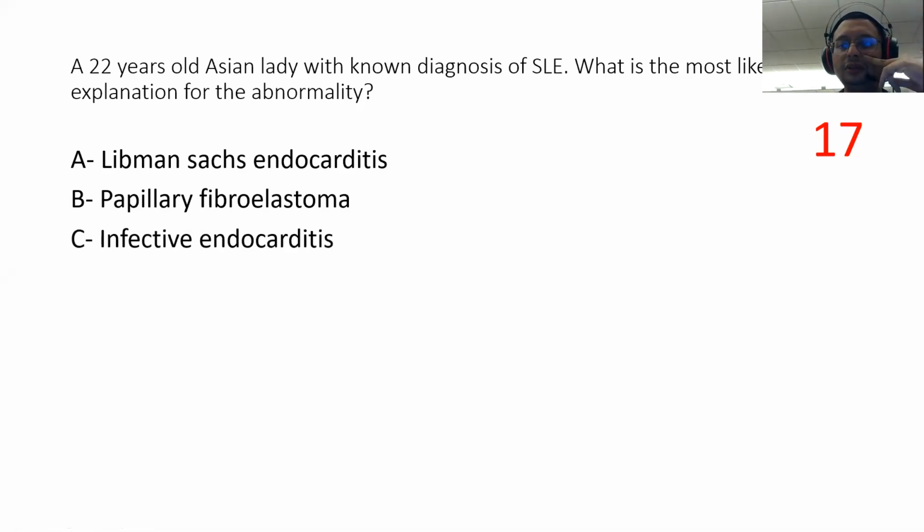Kissing? So can I ask, kissing mass meaning? I don't know. It seems like the mass on the tips of the anterior mitral valve leaflet, on the tips of the posterior mitral valve leaflet, then it kisses. Like that. Or mass on both the anterior and posterior? Yes, correct. Okay, but normal endocarditis also can happen like that. Also, right? Yes, definitely, correct. But this is more common in patients with Libman-Sacks endocarditis.